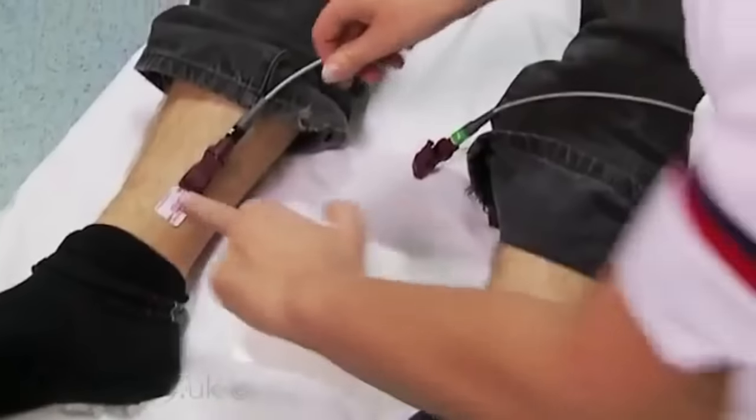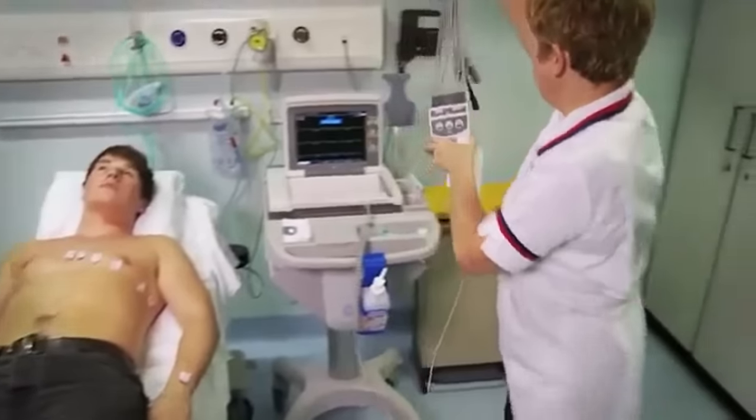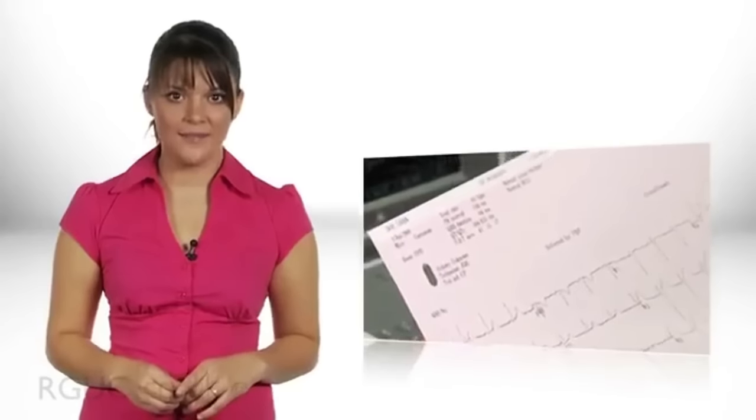Now the procedure is complete, allow the patient to redress. Clean and clear away equipment, storing it appropriately. Remove your gloves and apron if worn and clean your hands. Finally, document on the ECG trace as required. The patient details, along with the time and date of recording, may have automatically been printed depending on the ECG machine settings — if not, add this now. Also make a note of any change to the position of the leads, the position of the patient, or to the settings. Document the procedure in the patient's notes and inform relevant personnel that the test has been completed so that the results can be analysed.